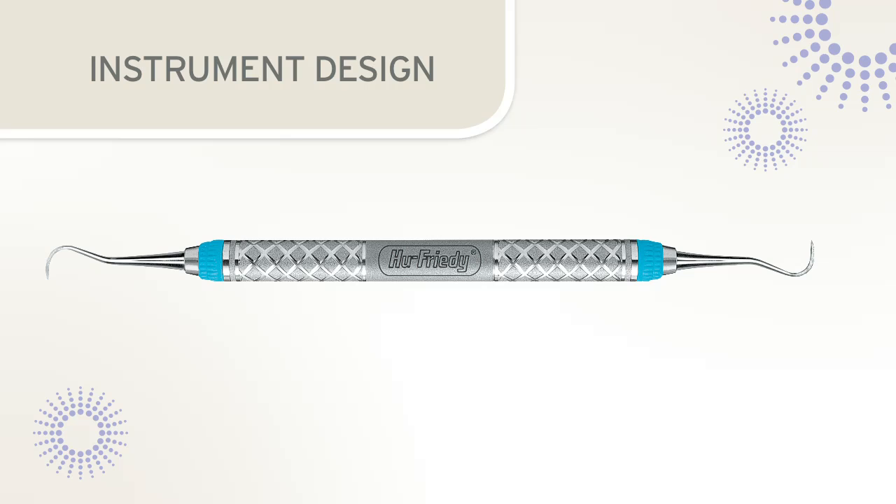The specific design of a scaler or curette will assist in determining the correct angles for sharpening. All dental instruments have a handle for grasping the instrument, a shank that connects the handle to the working end. Instrument shanks vary in design to allow adaptation to various tooth surfaces, and a working end that consists of a blade with one or two cutting edges.